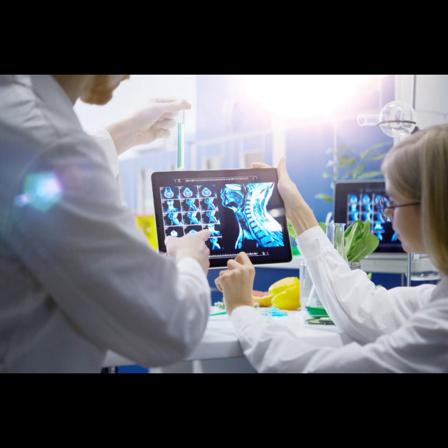Okay. How does radial sampling help with motion? That's like spokes on a wheel, right? Right. You shoot out from the center along one angle, then do another shot straight out along a different angle, and repeat many times. Think spokes radiating from the hub. What's the advantage? The big advantage is that every single shot passes through the center of k-space, k0. Remember, the center holds the main signal intensity and contrast information. By repeatedly sampling it, even if there's motion, the contrast information remains relatively consistent.